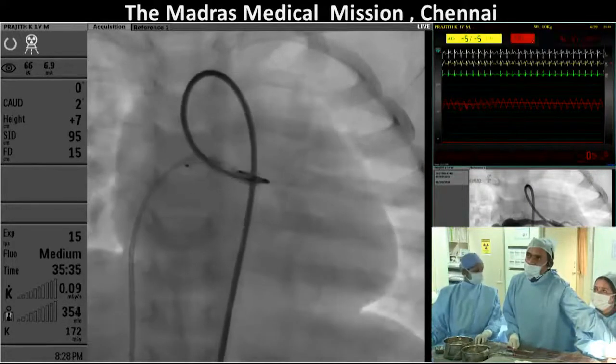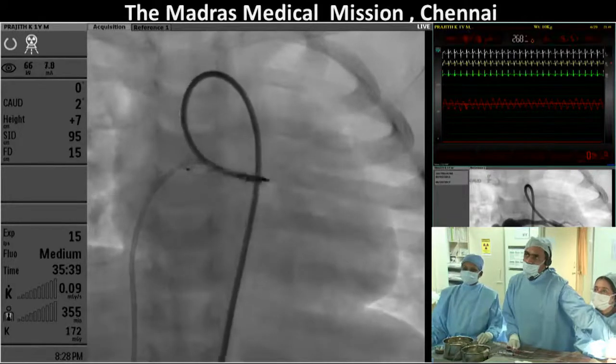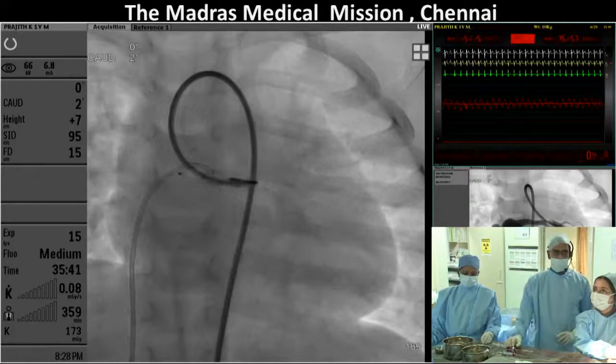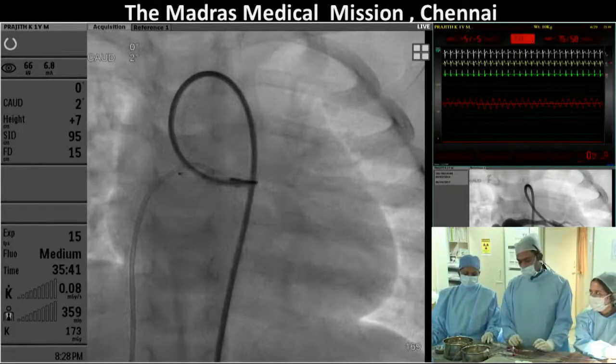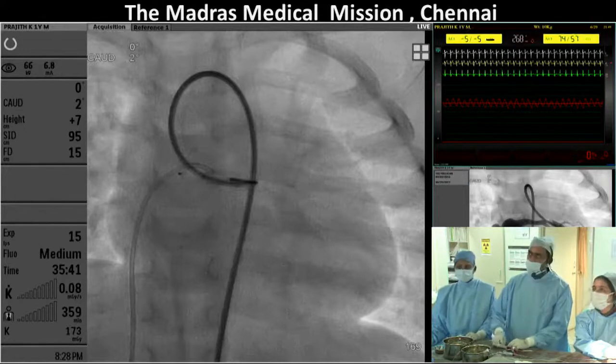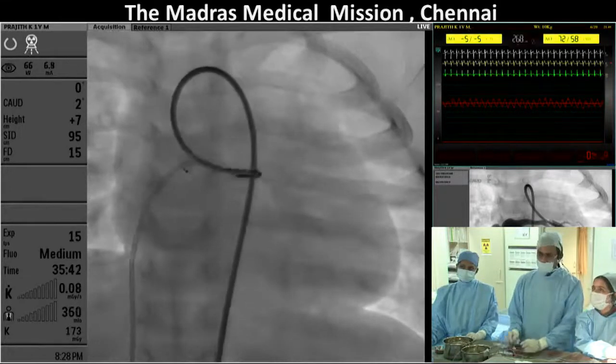before doing anything. And if this right atrial sinoatrial node artery came from the right, AV node is 90-10 and SA node is 55-45. At least that's what I remember. Anyhow, okay. Shiva, can you do an angiogram right through the coronary venous catheter? That would have been a good thing to do here. Yeah. So actually, do an angiogram through the venous catheter. Okay.